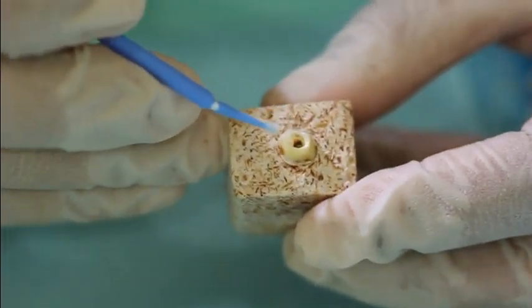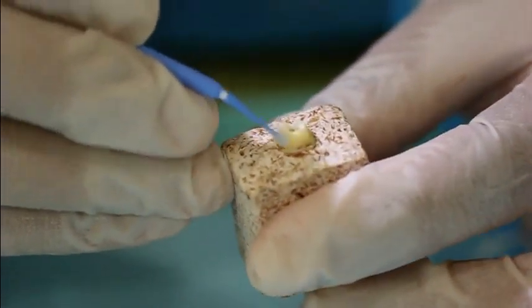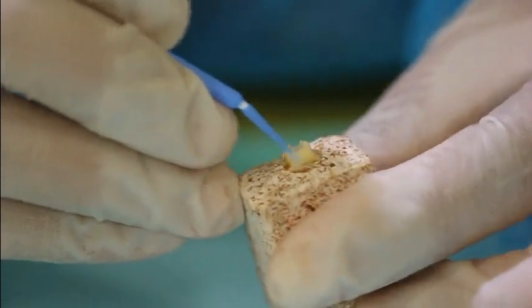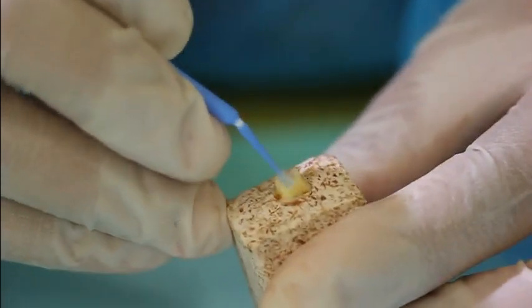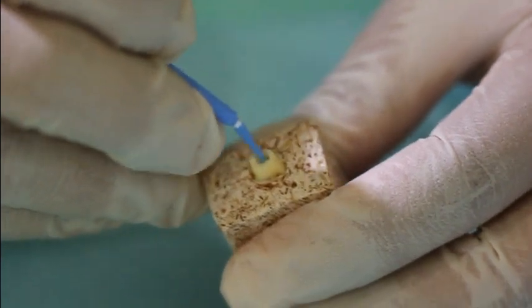Before you make your temporary crown, make sure you apply Vaseline on the prepared tooth, otherwise the temporary crown material will stick on the tooth surface. Please apply it on the coronal part of the canal as well.